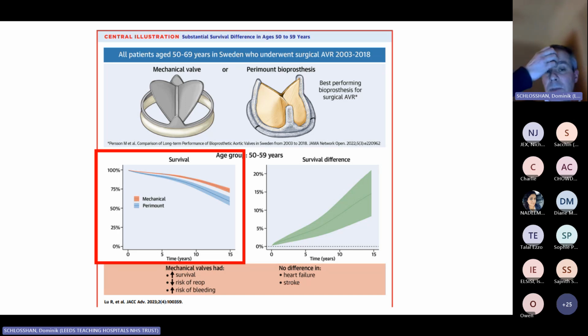And why is that? Well, it makes sense, because bioprosthetic valves, when they fail, and we'll see some cases, don't just gradually fail. They often can fail quite acutely. Equally, TAVI is another procedure, isn't always straightforward, and often hasn't been planned, or isn't always planned appropriately to put the right valve in. Not every tissue valve is suitable for a TAVI and valve procedure. So therefore, one has to be cautious about putting too many bioprosthetic valves in younger patients. And we always talk about lifetime management of patients with valve disease. And lifetime management does actually tell you that maybe you should consider a mechanical valve, but it's the patient's choice.